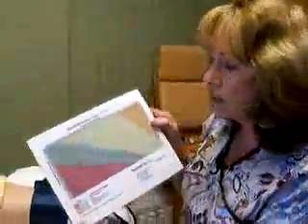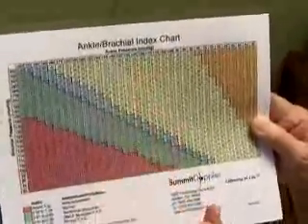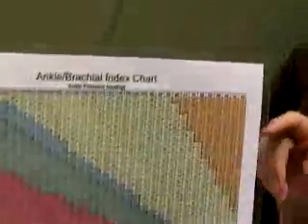So naturally the ankle pressure should be just the exact same thing as the systolic pressure. We have a chart as kind of a cheat sheet. So you locate the brachial pressure of 110, the ankle pressure of 110, and you come up with 1.00. And that is a normal ABI.